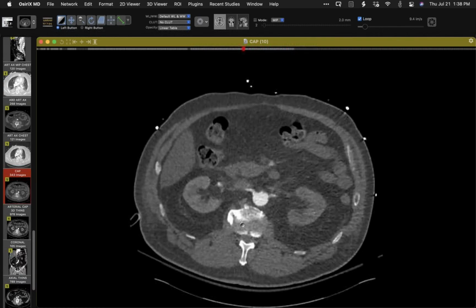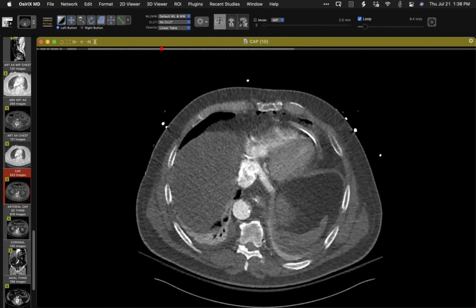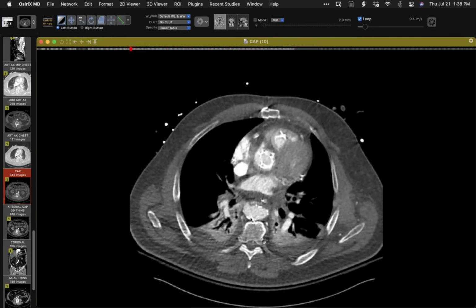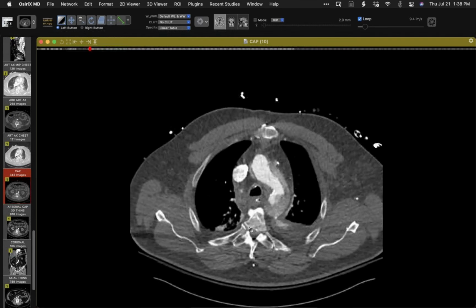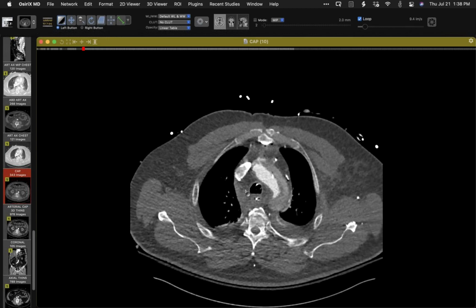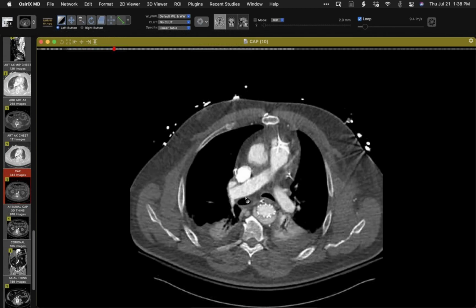So Howard, had the stent slipped? Did it slip distally? Was it initially placed near the back of the arch? Well, I think the intent was to put it somewhere, but I don't know exactly why it ended up being here, David. Okay.